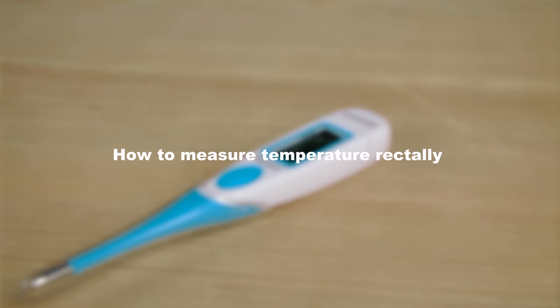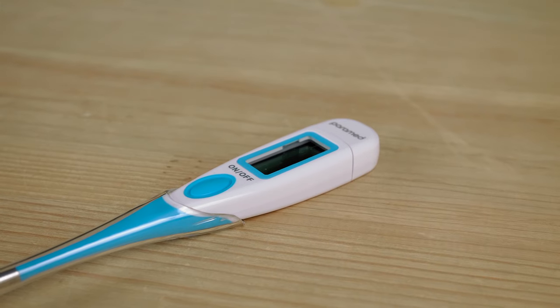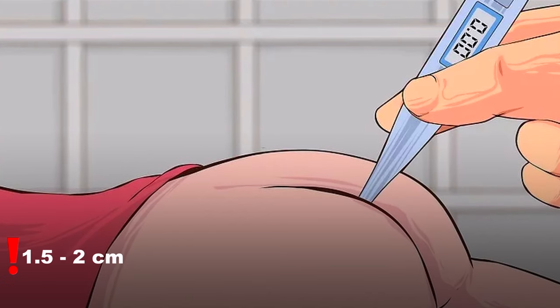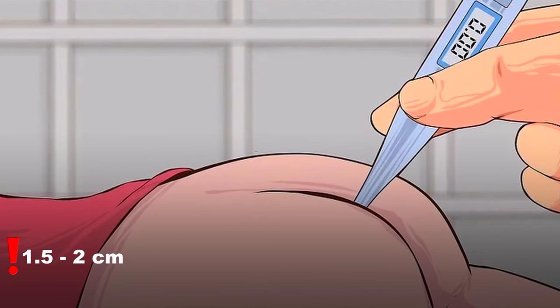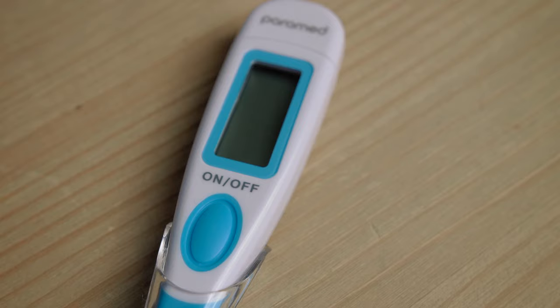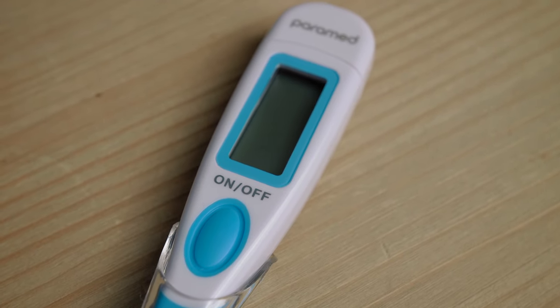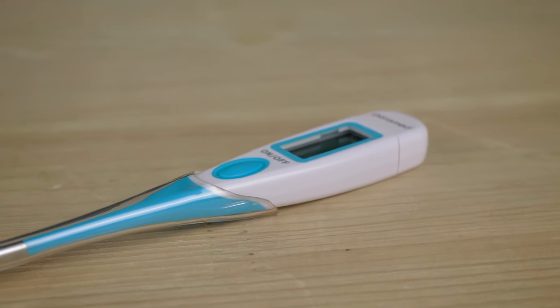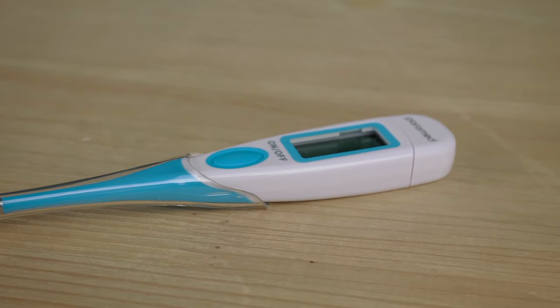How to measure temperature rectally. This method is considered the most accurate. You should place the sensor approximately 1.5 centimeters into the anus during temperature measurement, ensuring that the metal tip is fully inserted. The signal will notify you when the measurement is complete. Do not forget to clean the thermometer before and after use.